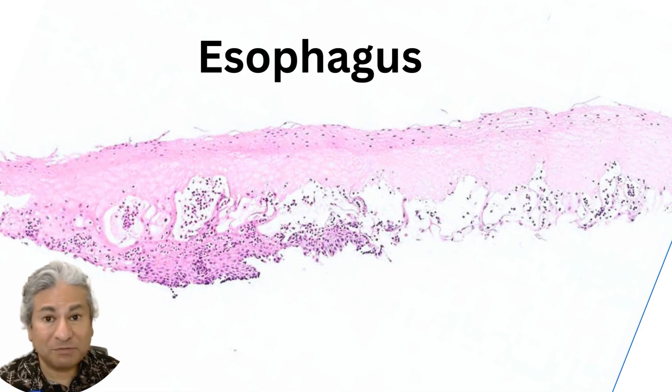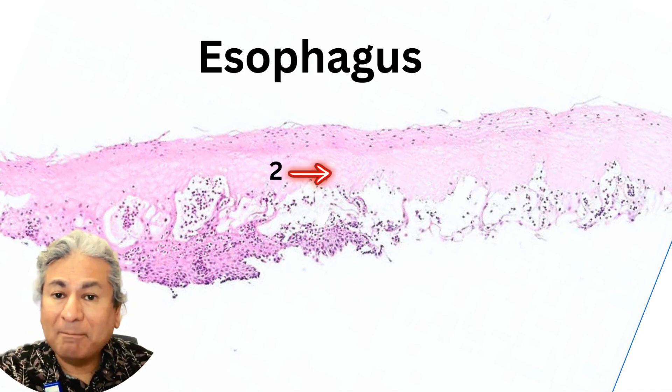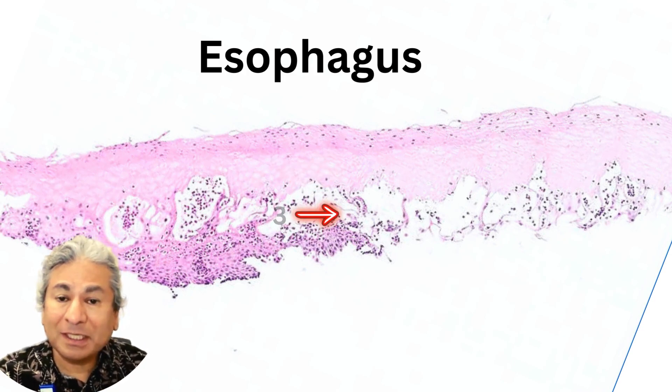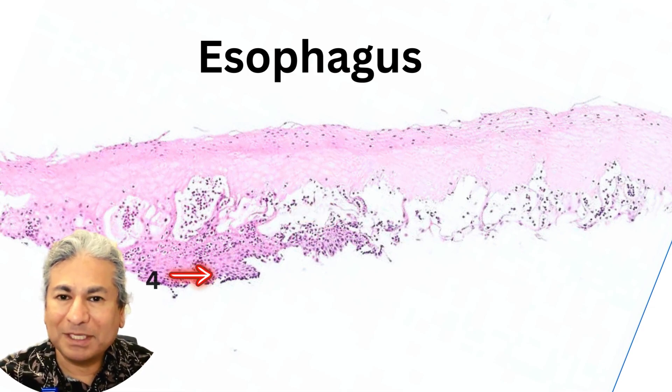Here's the esophageal squamous mucosa. You see four layers. The top layer is perikaratosis — at least some of those nuclei look histologically intact. Right beneath that is a layer of dead squamous cells, a mummified layer, if you will. And then under it is perhaps the most dramatic part: there's a cleft with perhaps some cells floating in it. And finally, an intact basal cell layer with slight basal cell hyperplasia.